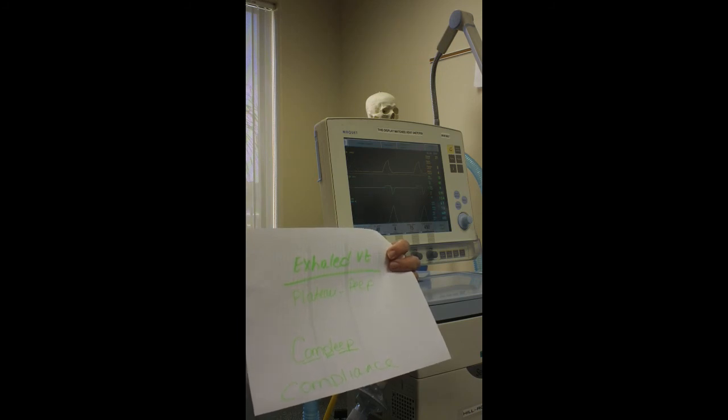Because if you're in volume control, just to give some examples, and your patient has a bronchoconstriction, your pressure will go up because of increased airway resistance. If you had air going through a garden hose, everything was happy. Our patient goes into bronchoconstriction, we got a straw. It's going to take a lot more pressure, right? So increased airway resistance, bronchoconstriction, increased pressures. We get rid of the bronchoconstriction, guess what? Airways open again, the pressures come back down. Patient is having an asthma attack on a ventilator, you're going to have pressures driving you crazy. And then what's your patient at risk for then?